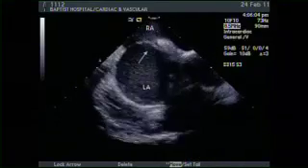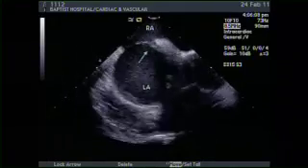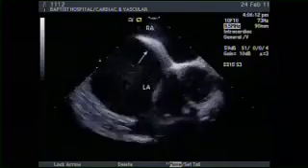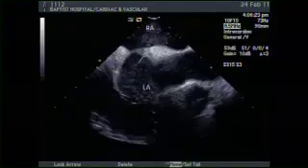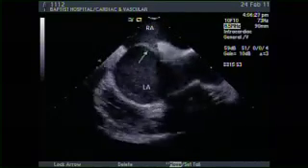So what we're going to do is I am going to get more fluids, and I'm going to pull this catheter out to do a good bubble study. Can you hold this for me here? Thank you. Give me the syringe. So we're going to get more bubbles. All right. Same procedure here. You can see it. And now we're going to do a real injection.